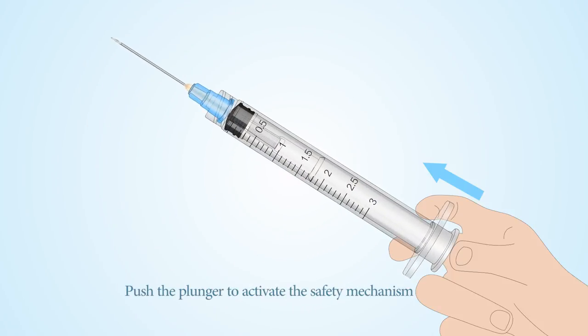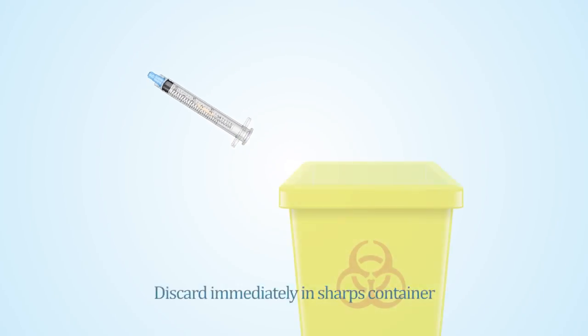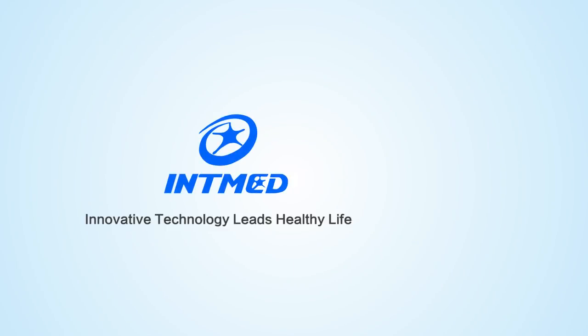Push the plunger to activate the safety mechanism. The needle will retract into the syringe barrel automatically. Discard immediately in a sharps container.